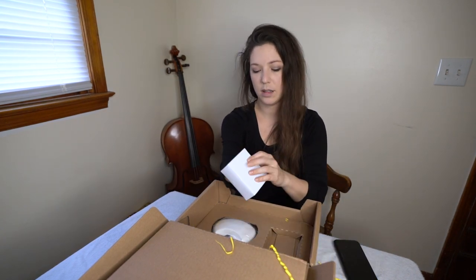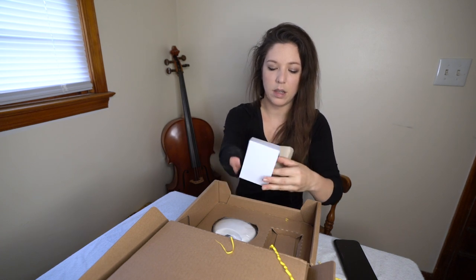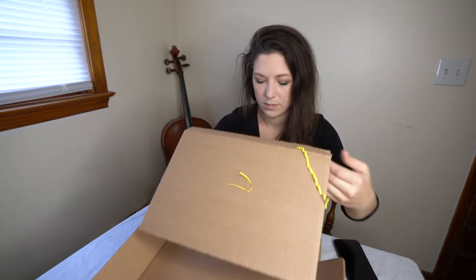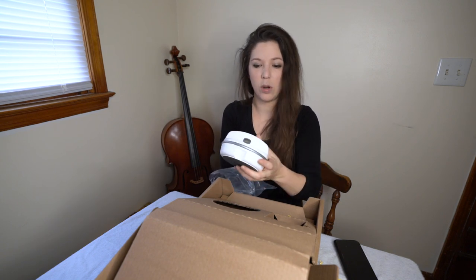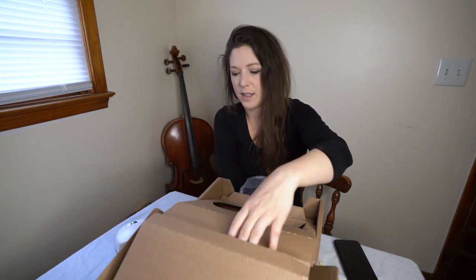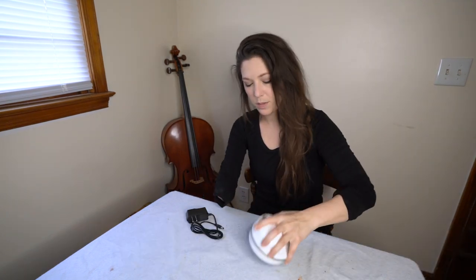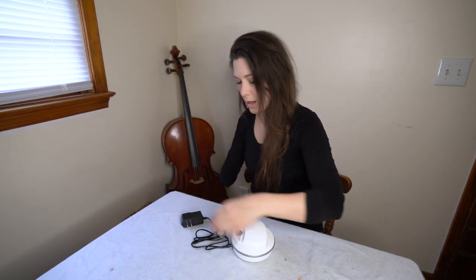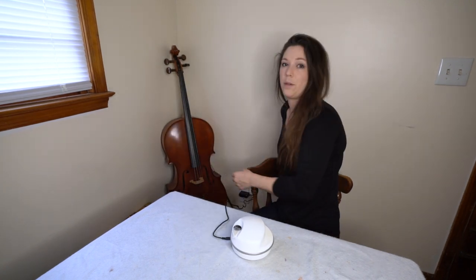The box contains the charger as I thought, and here it is — very nice, small, sort of compact appliance-feeling thing. The power cord plugs into the input here, and I have a power outlet right behind me. Let me grab my instructions again. Fortunately for this video I have semi-long nails that seem like they could use a trim, so that worked out.